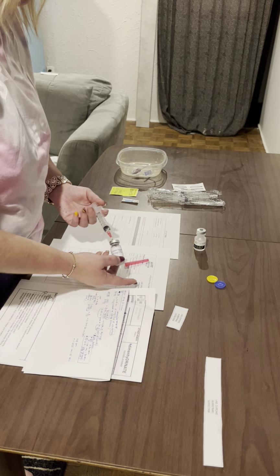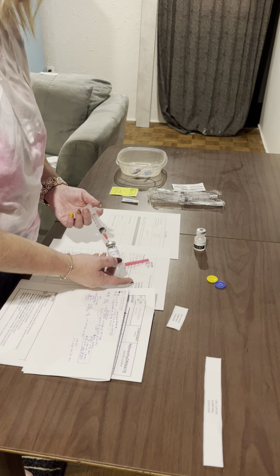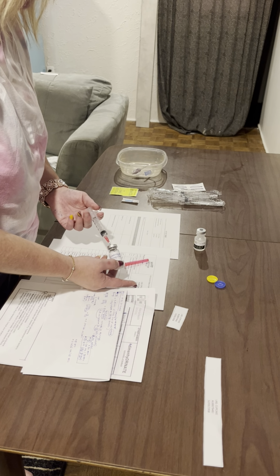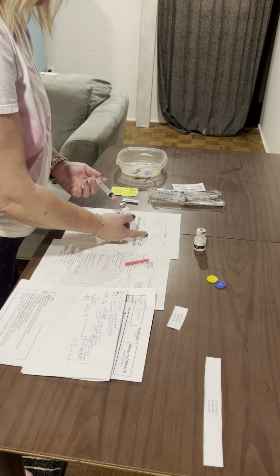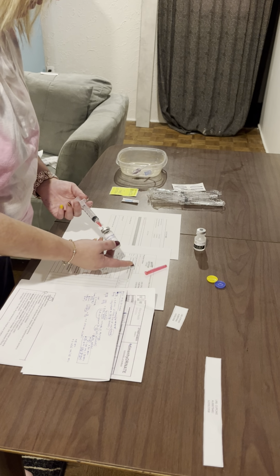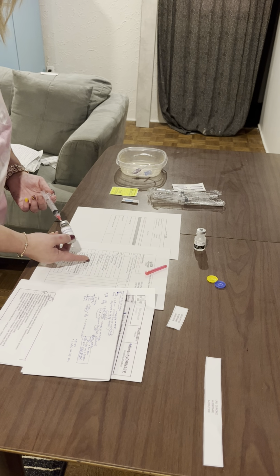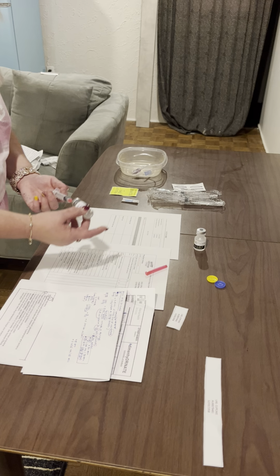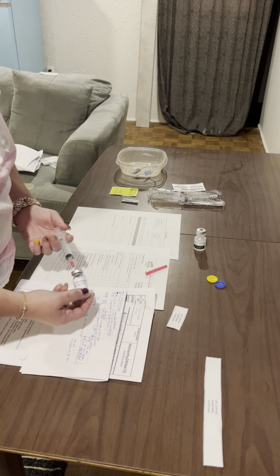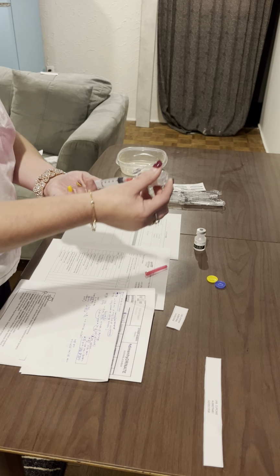So we have Cupcake Lab, December 3rd, 1958, Alberta Health number 79481. We're also giving this today. We know we have the allergy to Cipro. This is not Cipro, this is dimenhydrinate. And we'll go down the orders: dimenhydrinate, 25 milligrams IV direct now. This is the dimenhydrinate. Okay, we're good there. We have the monograph for the dimenhydrinate, and of course the med math. So that would be our second check.